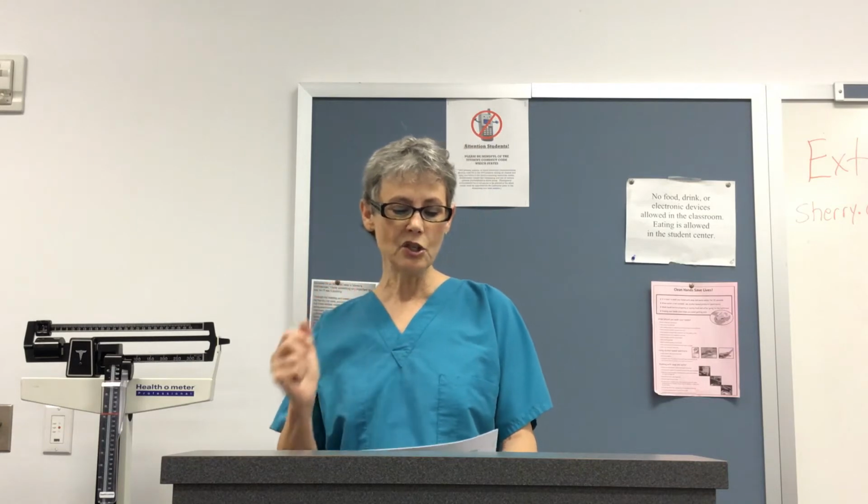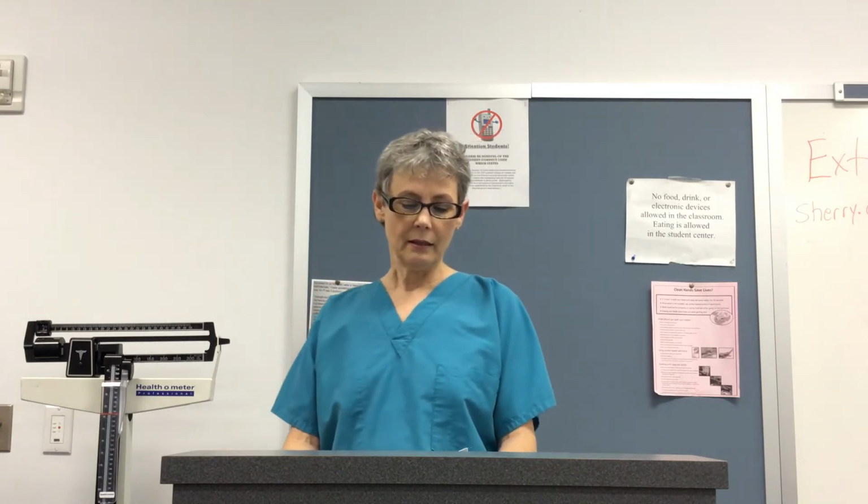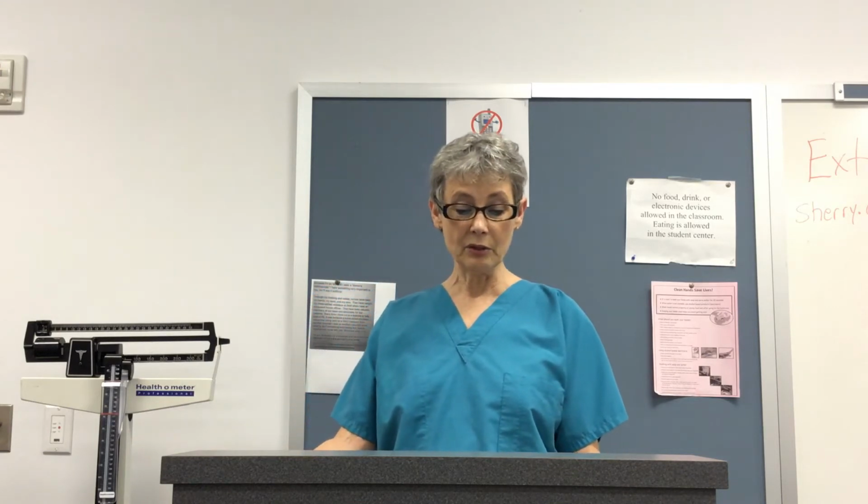Also, you'll need to check for allergies. See if the patient is allergic to shellfish, iodine, the chlorhexidine gluconate, also known as CHG. You may see those initials. Alcohol, latex. Those are all things that you will be using or possibly use when you're starting your IV. And then, of course, always check for medication allergies.